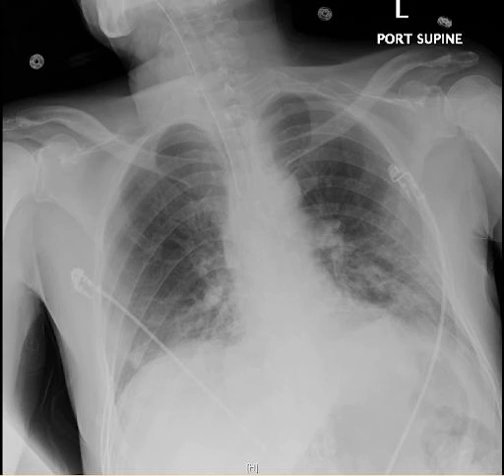So first and foremost, the most common one is chest x-ray. And these are very easy to obtain, very common tests that we get on a lot of patients with respiratory complaints. And there's a classic pattern that you see with COVID. That's ground glass infiltrates or patchy infiltrates in the lateral aspects and the inferior aspects of the lung. So that's what you'll see most commonly if someone presents with severe COVID infection: lateral and inferior pulmonary infiltrates that are somewhat diffuse.